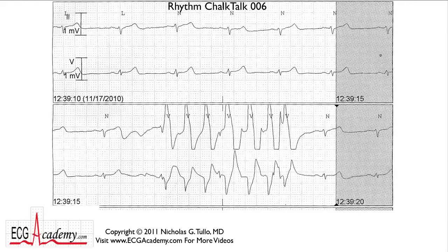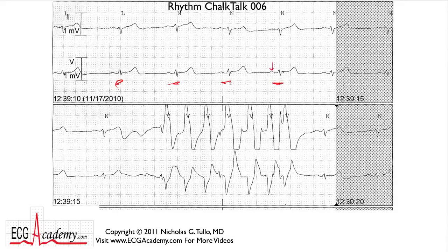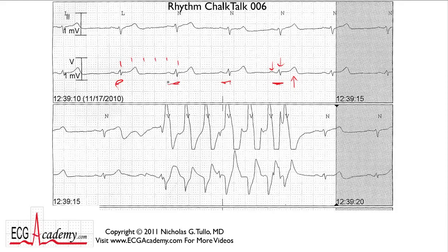The first strip shows two leads running simultaneously, and then a second strip from the same patient. If you look at the first strip, you can see a fairly normal, regular looking EKG with a P wave, a QRS complex, and a nice looking T wave. If you measure the rate — counting off 300, 150, 100, 75, 60 — it's a little bit faster than that, about 64 beats per minute. So it would look like a normal sinus rhythm.